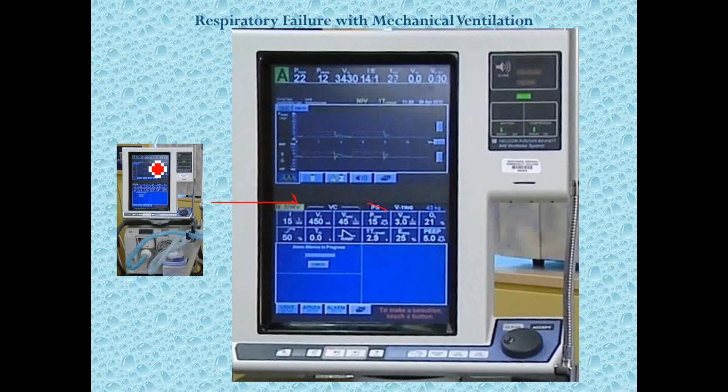We've also increased the length of tubing between the patient and the ventilator. So the endotracheal tube and the tubing to the ventilator itself increase the work of breathing for our patient that we want to breathe. So we're going to give them a little help as we start to wean them off the ventilator, and that help is in the form of pressure support. Now, you don't have to know numbers, but I've given you numbers so that you get a sense of what I'm talking about.